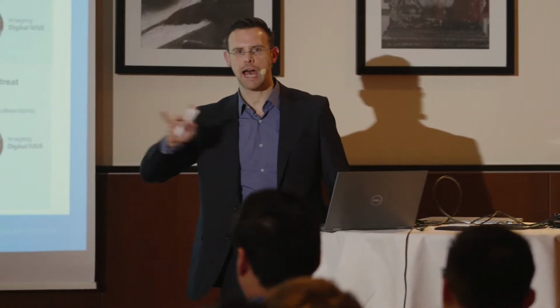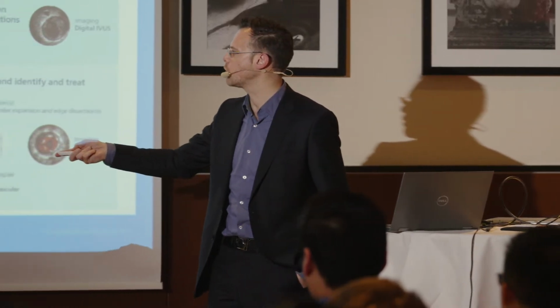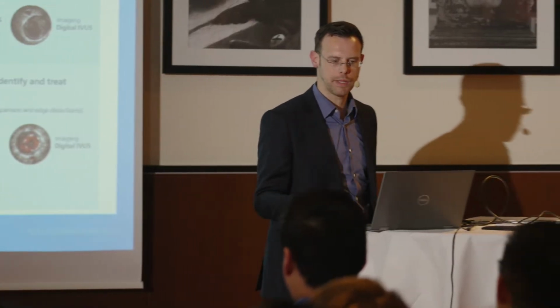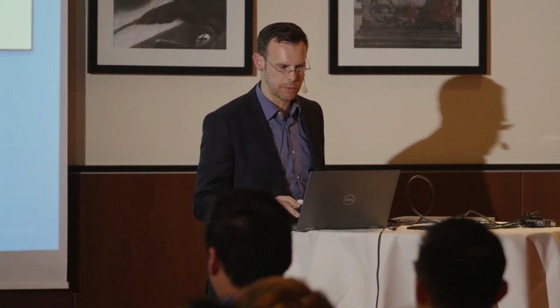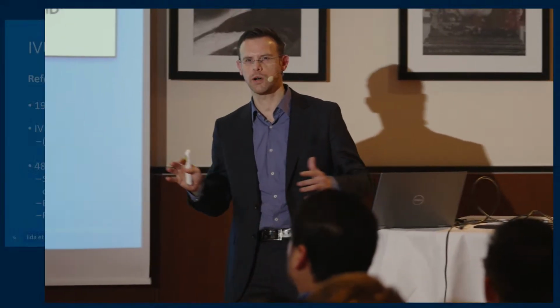So this is a workflow which we're probably all instinctively using, but this really goes to show that IVUS has a utility in every step of that workflow in giving you that information that I've already alluded to. And we'll talk about this in a little bit more detail now. I'm sorry to disappoint you. The promise was of something a little bit more clinical. This is a little bit more theory.